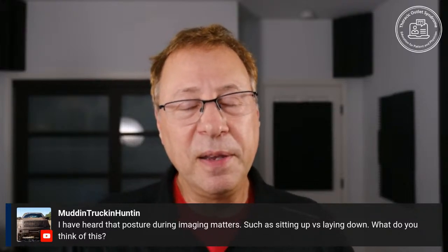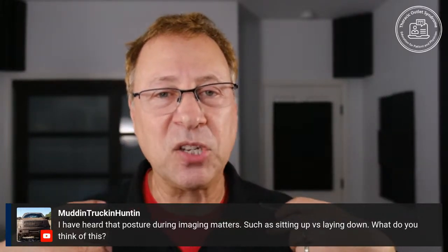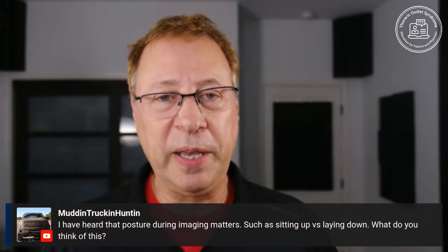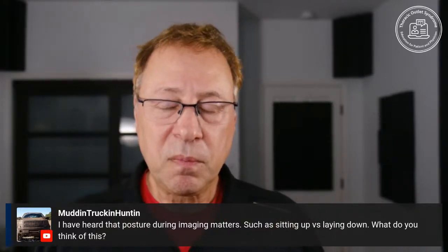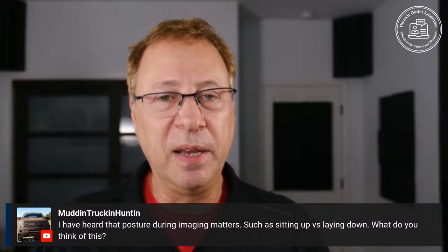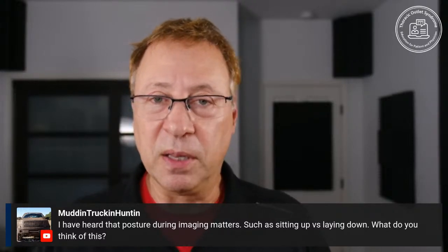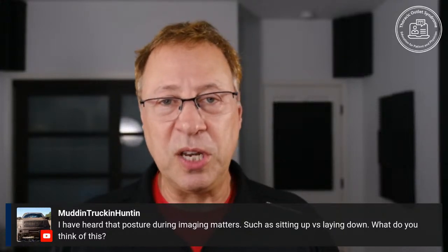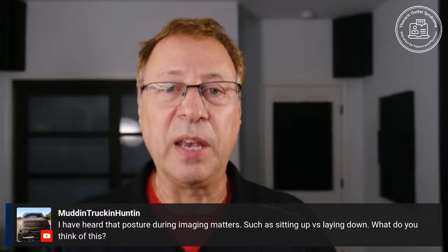And I think it should be easy to imagine that the weight of the shoulders when you're laying flat on an MRI table or a CAT scan table is very minimal. But when you stand up and you've got the weight of the shoulders and the arms pulling things down, including the collarbone, you would increase that amount of compression. So whatever we see on MRI, I assume in normal life where a patient is sitting or standing, that compression is actually going to be worse. We're thinking of doing a study to try to prove this, but the question is excellent. I think it's been proven on previous arteriograms. Of course, they couldn't see the brachial plexus with the technology at the time, but I think it's absolutely true. Thank you for the good question.